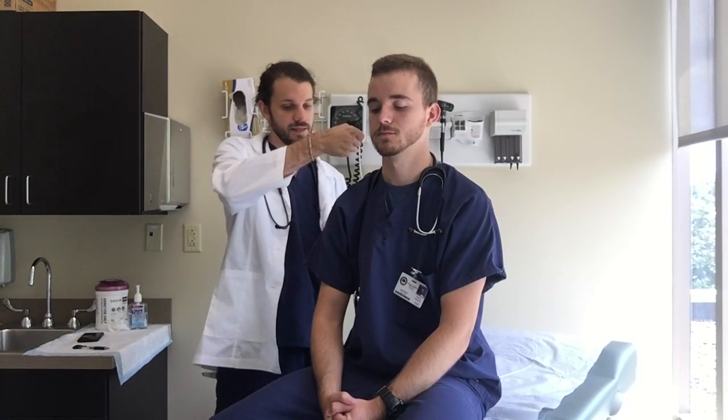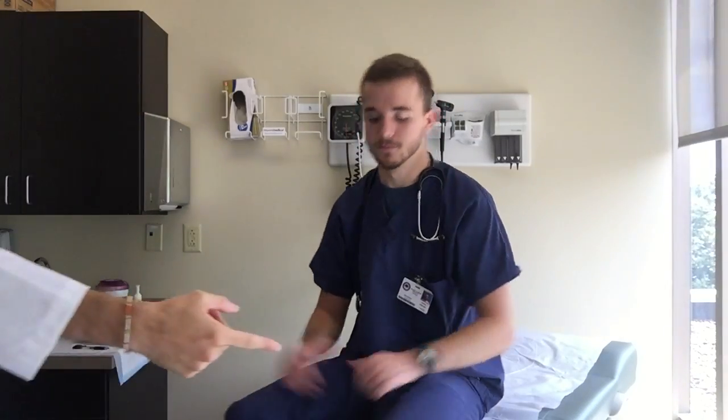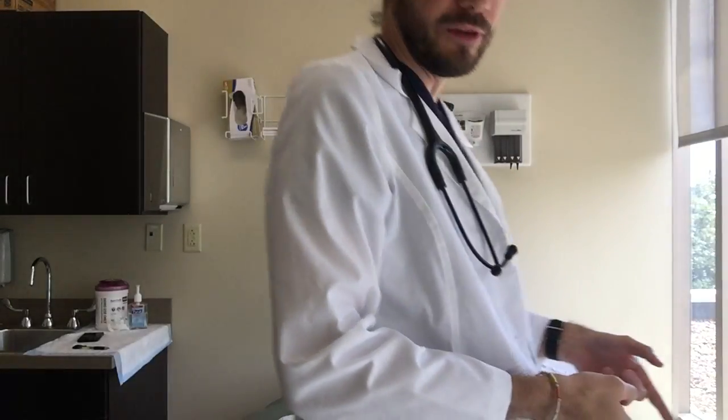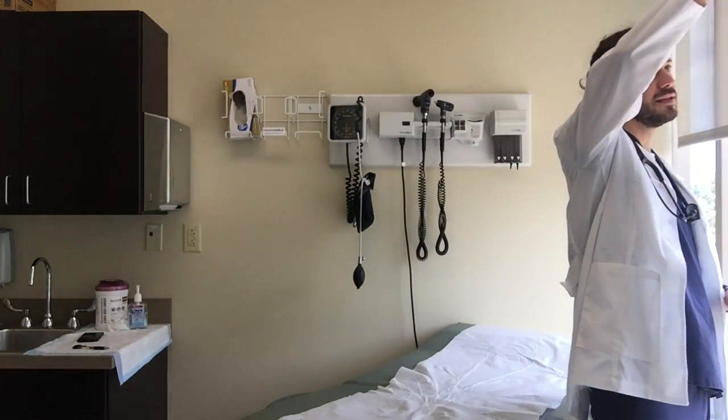Take his temperature: 98.7. O2 stat: 99%. I'm gonna have him step on our fake scale here. Weighing him on the fake scale — 195, pure muscle, six foot seven. Crazy.